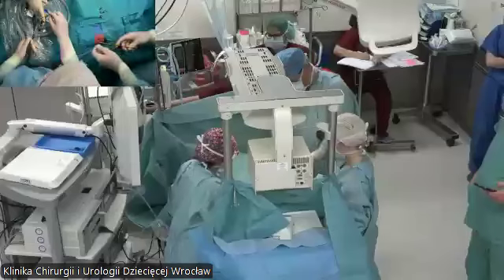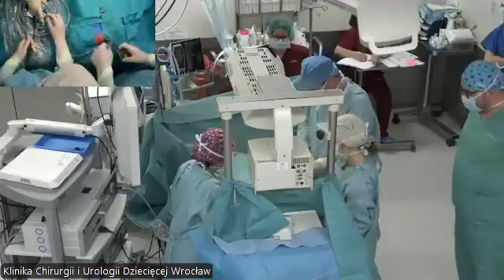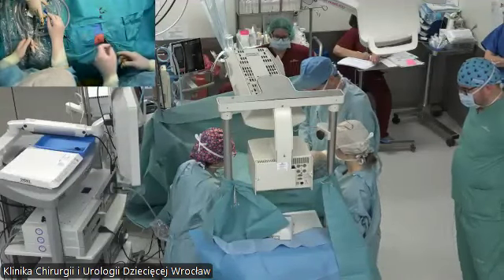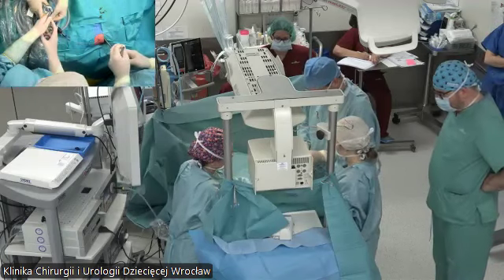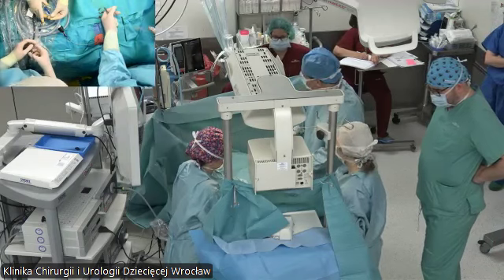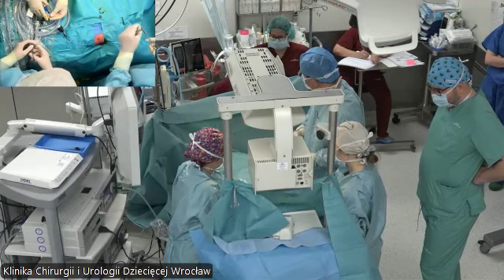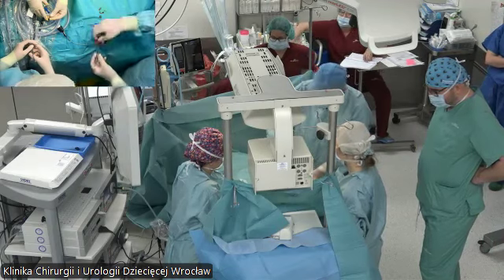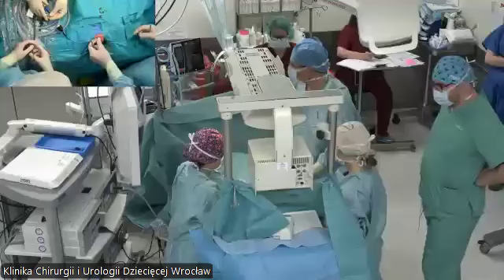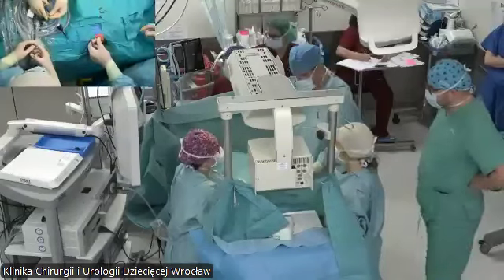We don't hear. Okay, I will repeat, please. So this is the answer from my excellent anesthesiologist team: they increased the insufflation pressure and the rate of ventilation, but the saturation was almost above 90%. Okay, thank you very much. And also the oxygen, but right now it's 25% oxygen, so it's not so bad.